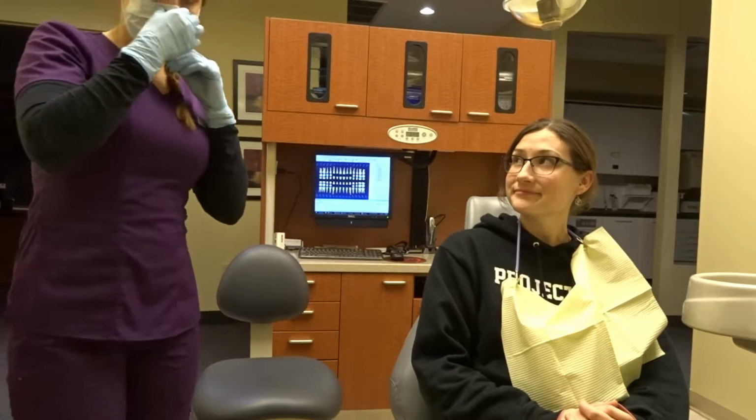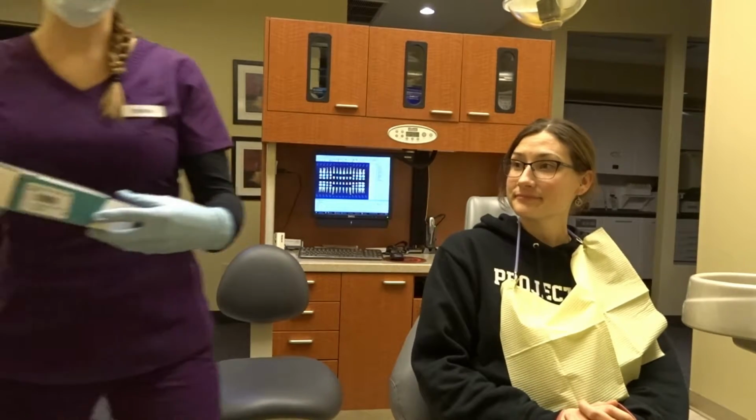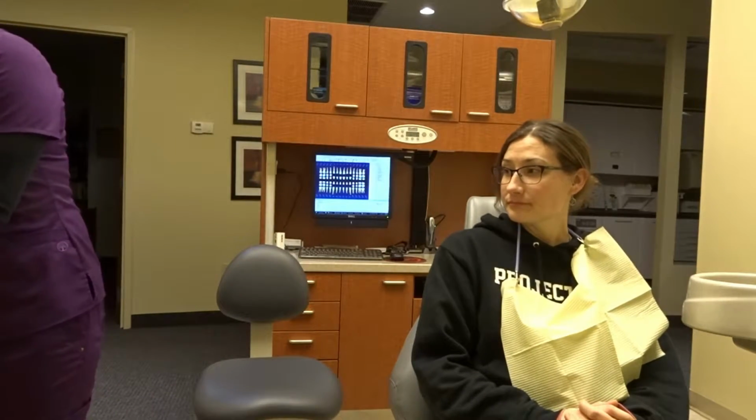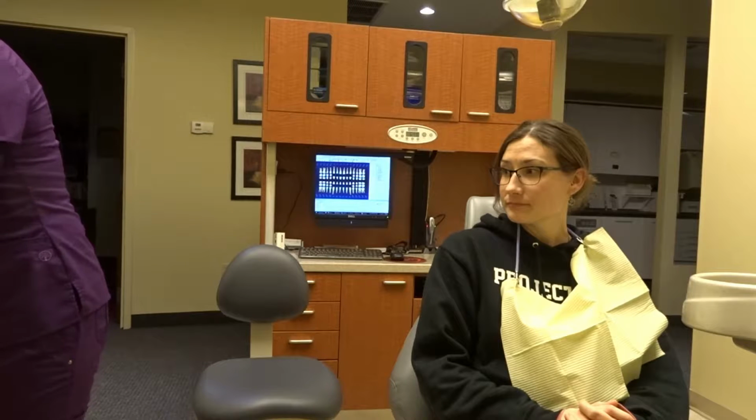Okay, so this is the test that we will be completing.